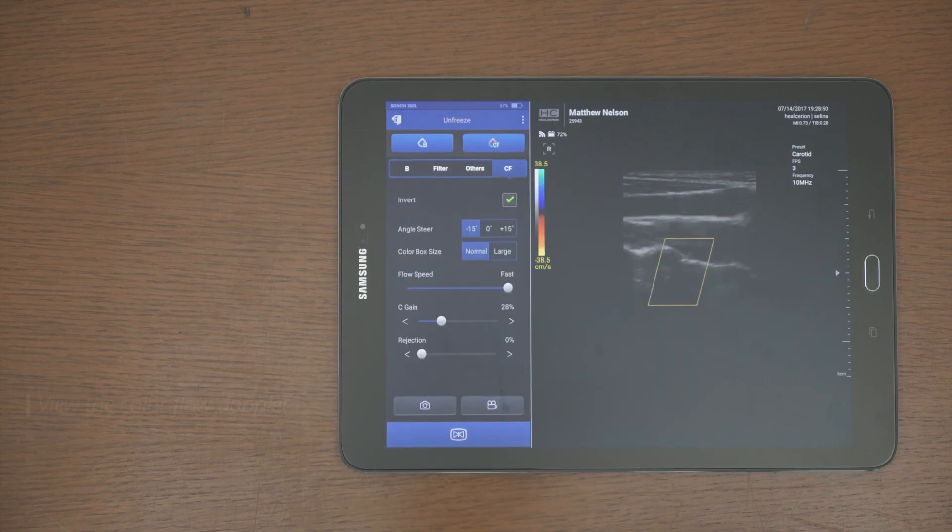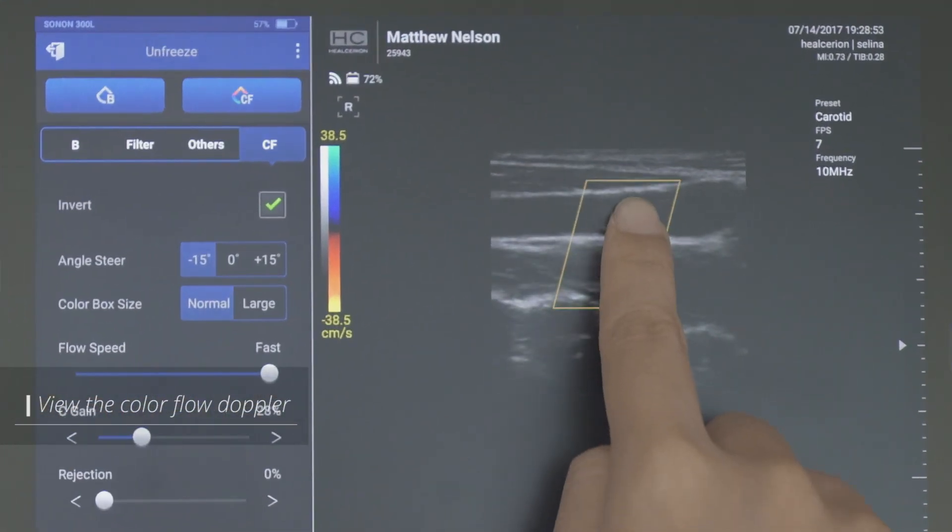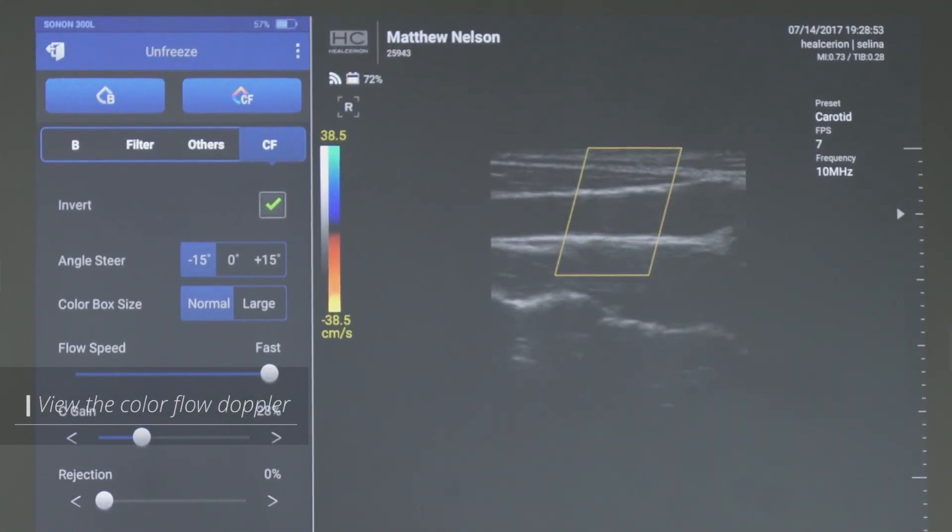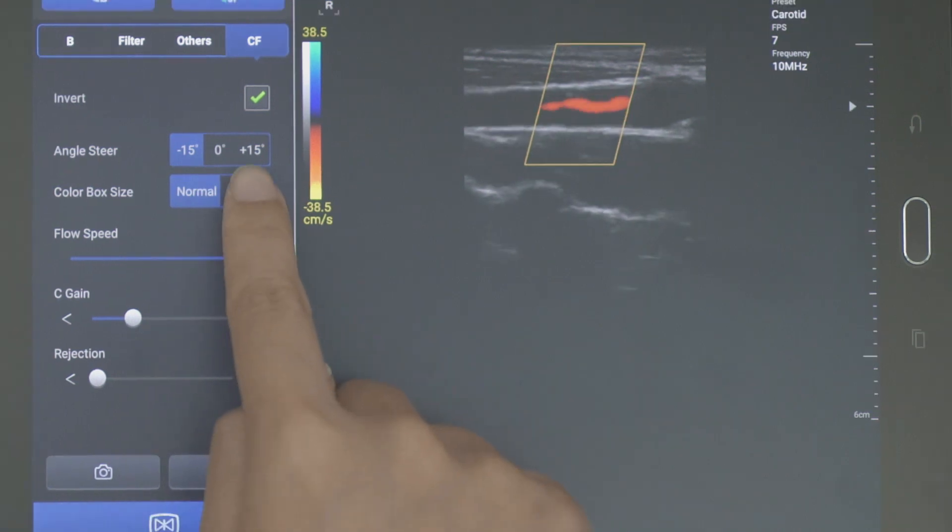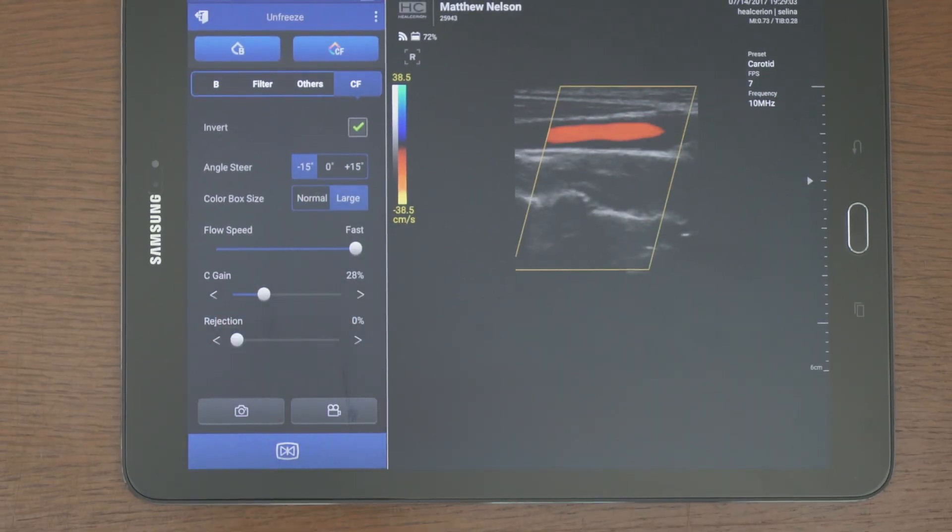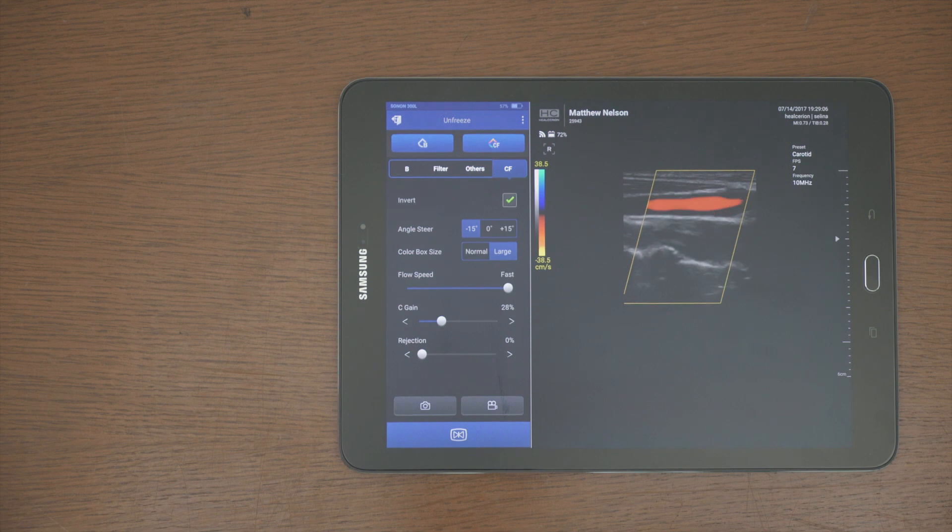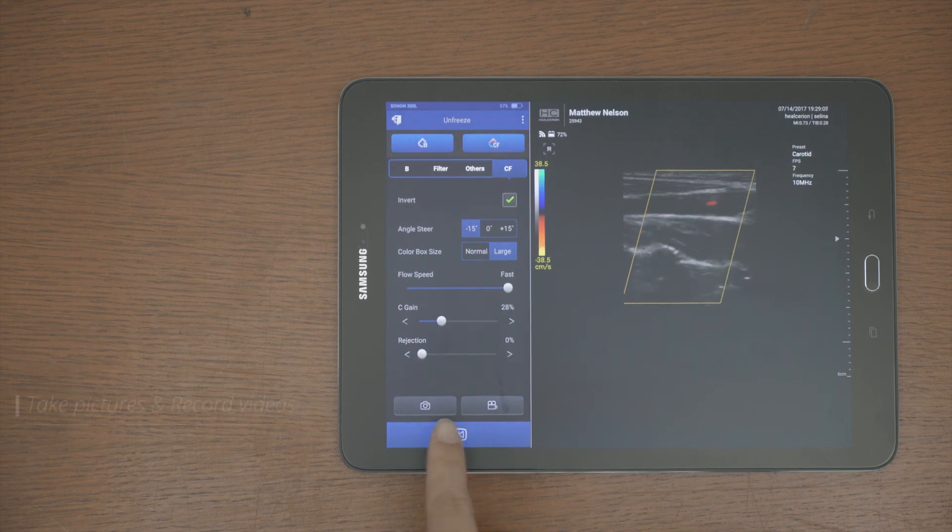You can tap the CF button to view the Color Flow Doppler image. And the color box is available in large size when the depth is over 5 cm. Please be aware that the color box cannot be moved while the scan screen is zoomed in.